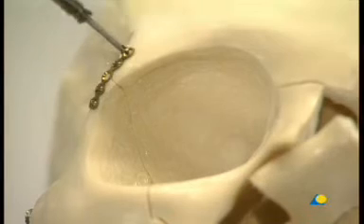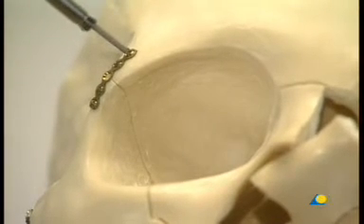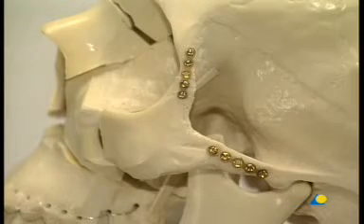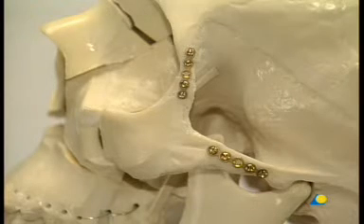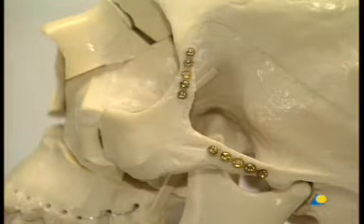If the alignment is correct, the two remaining screws are now placed in the first plate. The fixation of the zygomatic complex is repeated on the opposite side of the face, with a 1.3 plate placed at the zygomatico-frontal fracture and a 1.5 plate on the zygomatic arch.